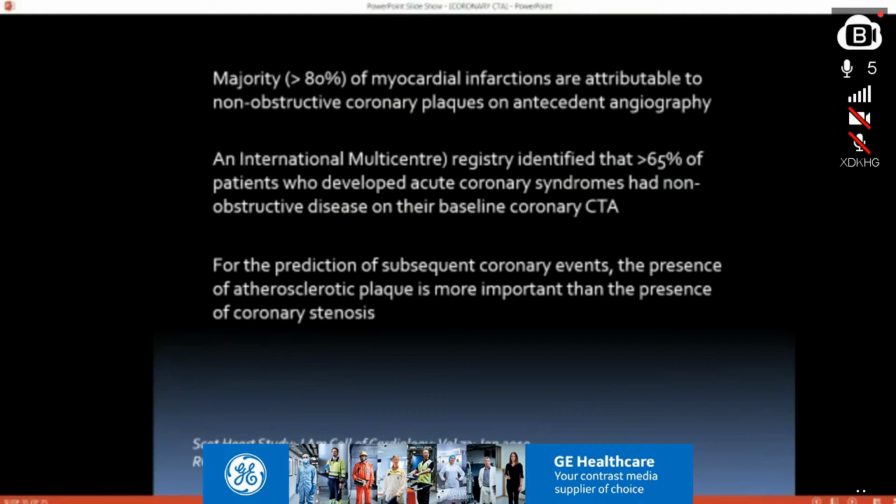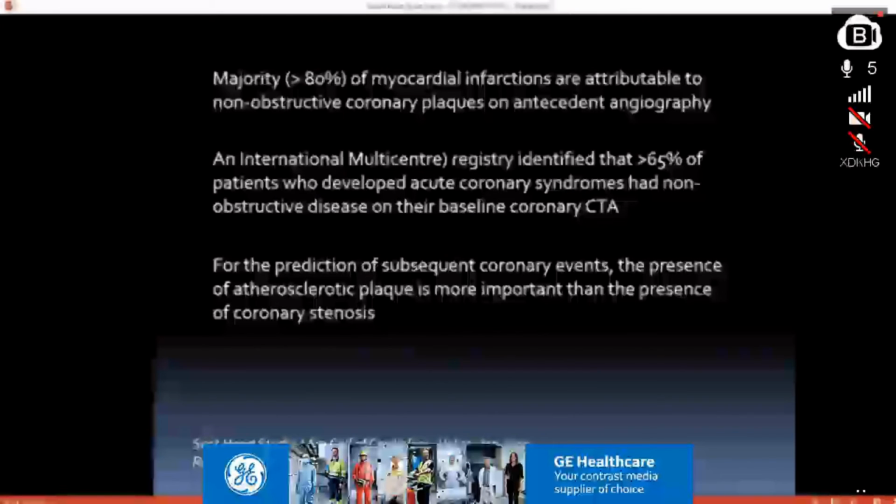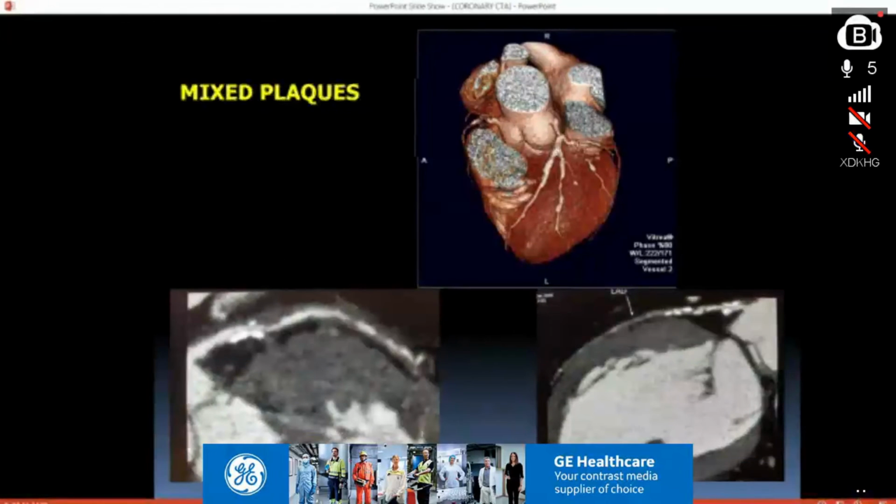Another important concept in total coronary occlusions is the enhancement of thrombus or linear enhancement within the thrombus. If you have a scenario of a chronically occluded proximal vessel, and if you can see linear enhancement in this vessel wall, it invariably means that this vessel can be dealt with easily on transcatheter manipulations, and you can pass the guide wire through these plaques if you see the linear enhancement within the thrombus.